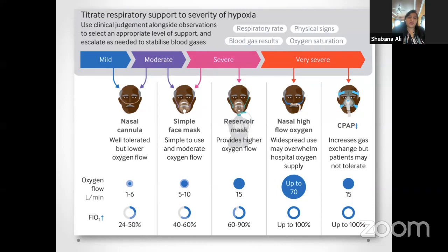But the advantage of the nasal cannula, of course, is that the patient can eat, drink, and talk, and it also reduces the risk of carbon dioxide rebreathing. They are just breathing in and out as normal. As I said, a dry nasal passage can be a problem initially, but with continued use, it can resolve itself.